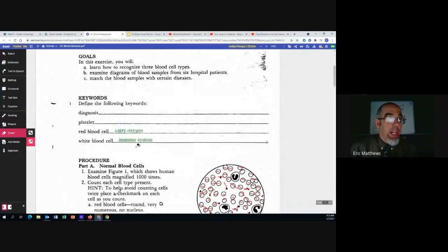So, ladies and gentlemen, that's the lab. There's nothing more to it. Count your bloods, record it, identify the disease, answer questions. Easy peasy, lemon squeezy. All right, so if you have any further questions, please let me know. Otherwise, I'll see everybody in class.